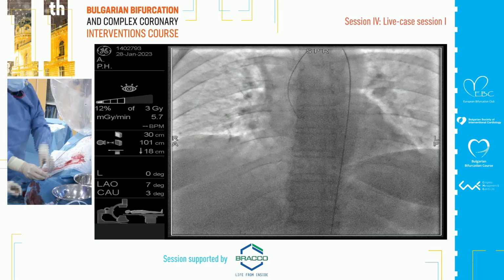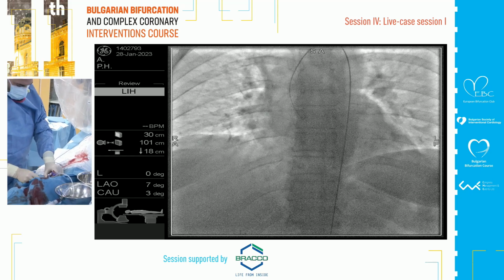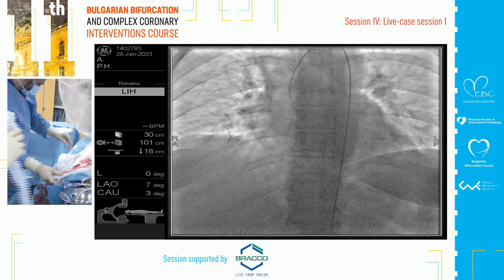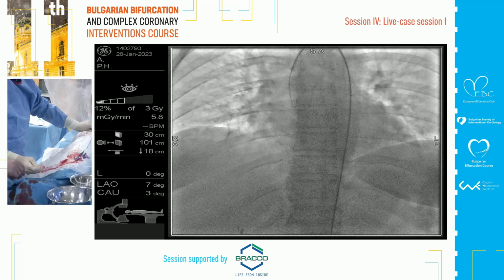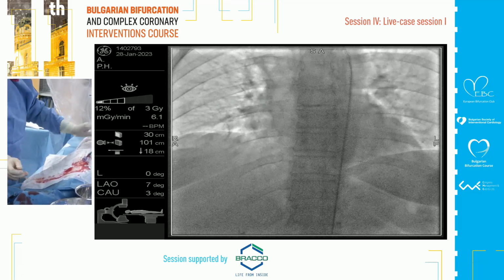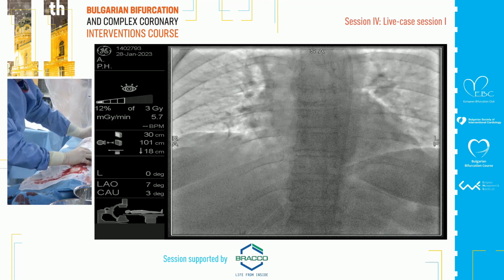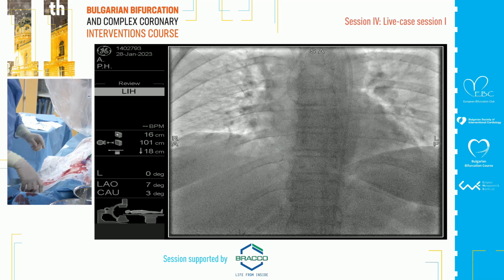So her RCA stent was just last year. If you were to wonder what is the mechanism of the ostial lesion, you might say number one, that there was some mild disease that grew worse. The second is that you traumatized the ostium with a guide catheter while you were doing it, and then it got worse because the lesion is extraordinarily soft, not fibrocalcific at all. Not that it makes a difference in terms of treatment, but when you look at the mechanism. So what guide are you using? EBU, I think.